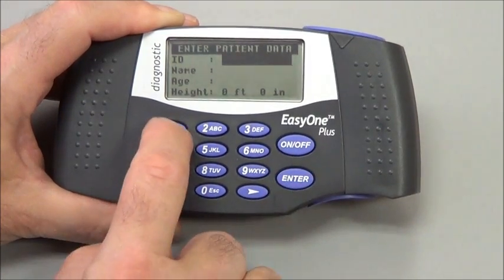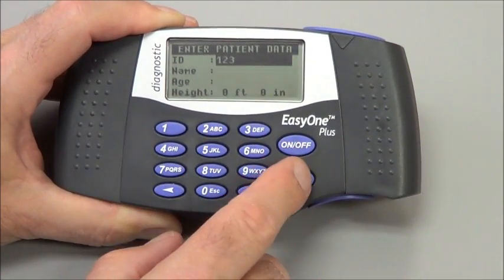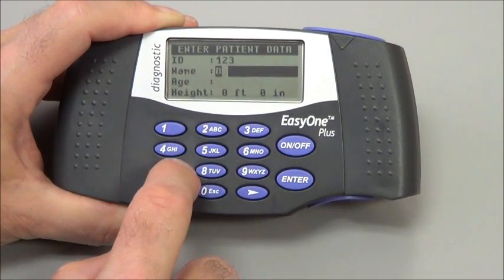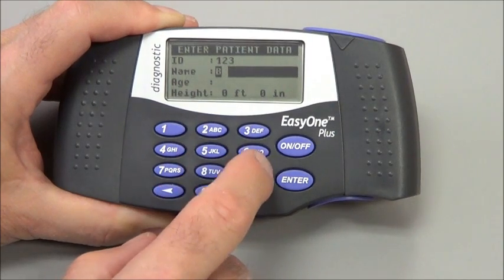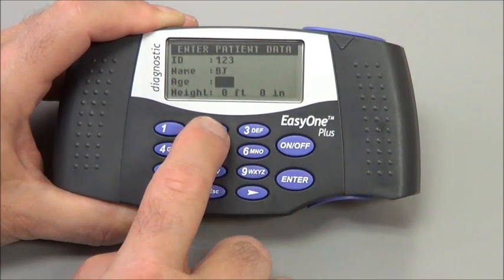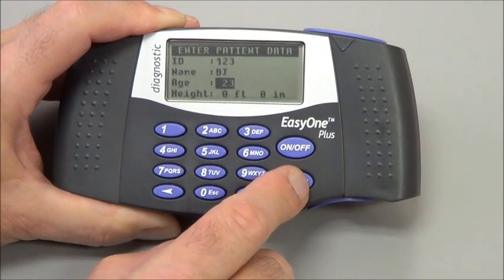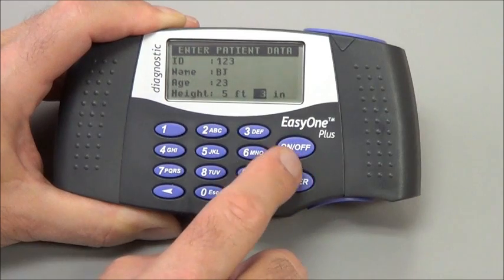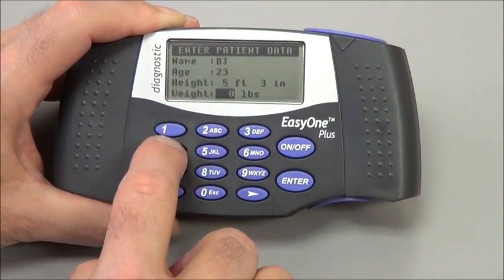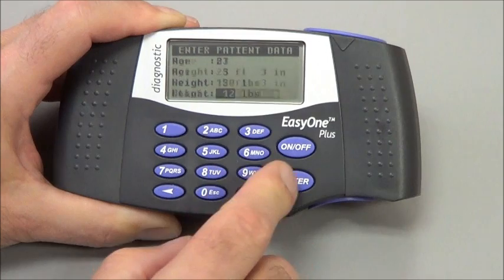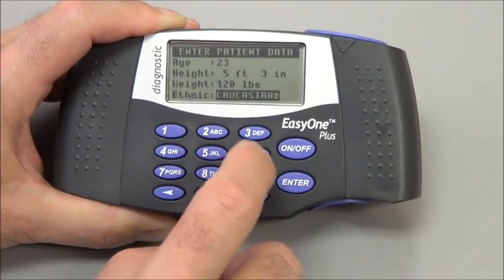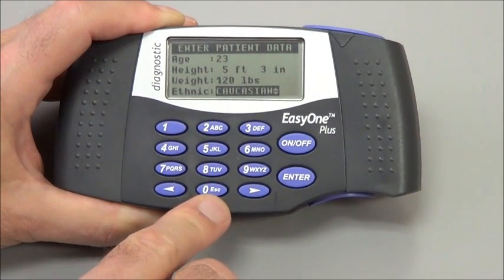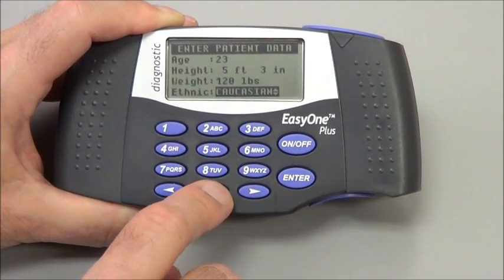The ID and name are optional, but I'll put something in here. In this case, I'm just going to add an initial instead of a full name, but you can add a full name if you like. The patient's age and height — this information is very important and needs to be accurate. Weight is optional, but you can enter that; it will give you a BMI index if you do. By the way, if you make a mistake on the Easy One, it's very easy to go back and fix it by pressing and holding the zero key, which acts as an escape key.